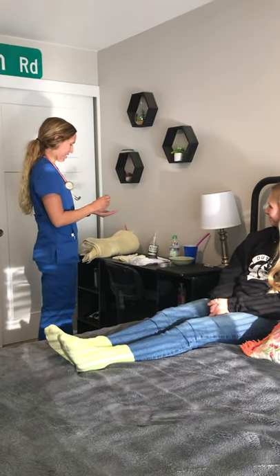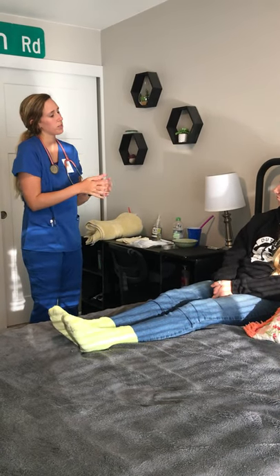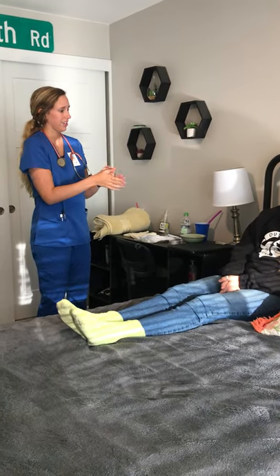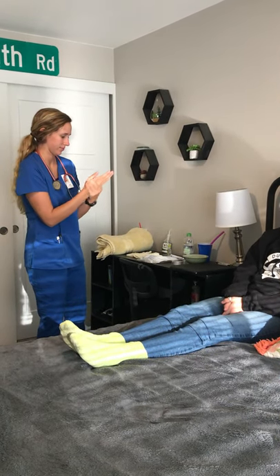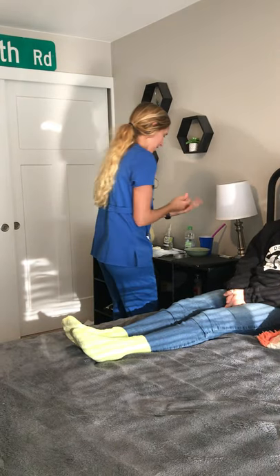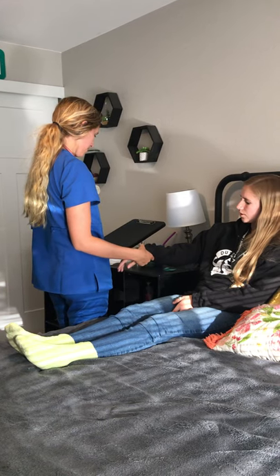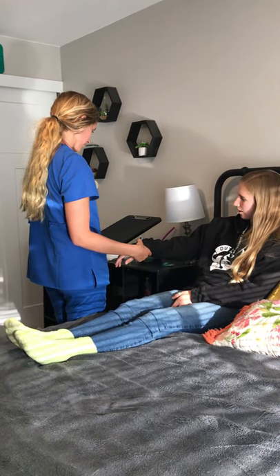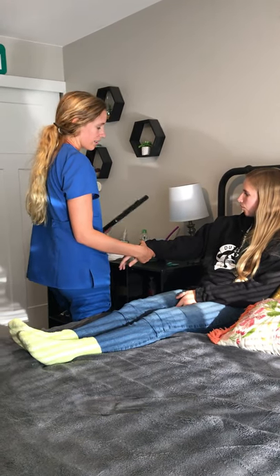Good morning. My name is Rachel, and I'm going to be your nurse today. How's your morning been so far? I'm going to go ahead and verify your name and birthday. Colleen Smith, July 28, 2000. Perfect. Do you have any allergies, specifically to latex? No. Awesome.